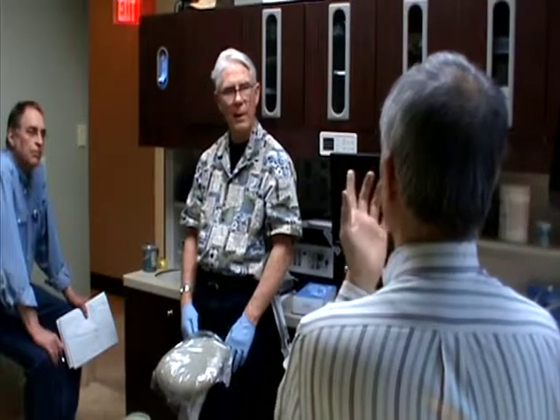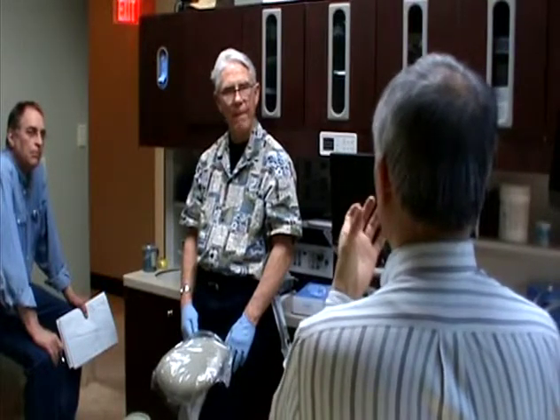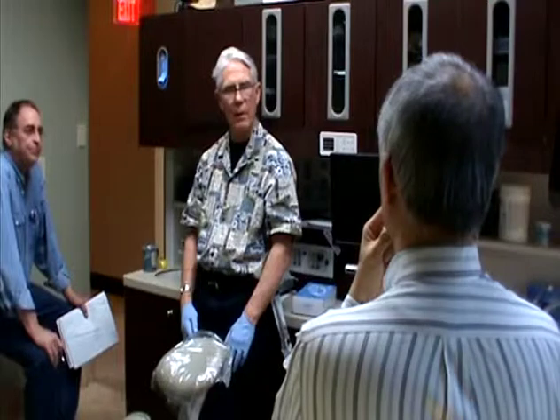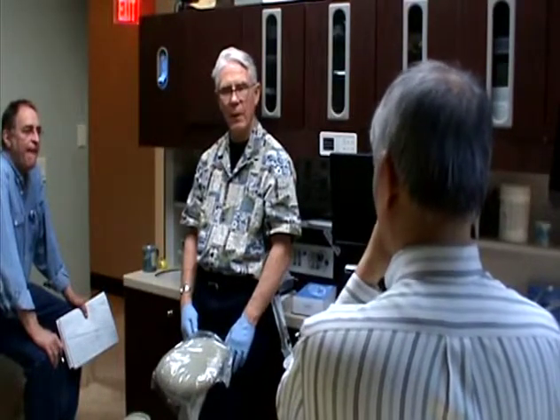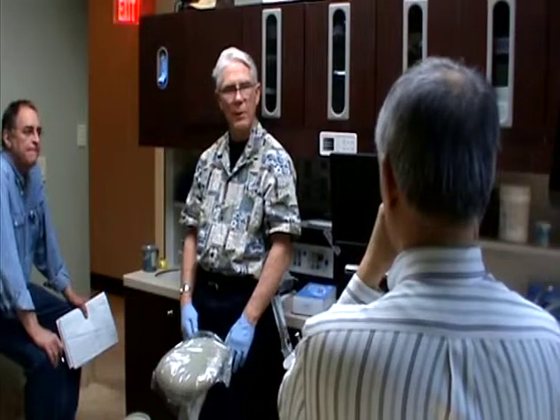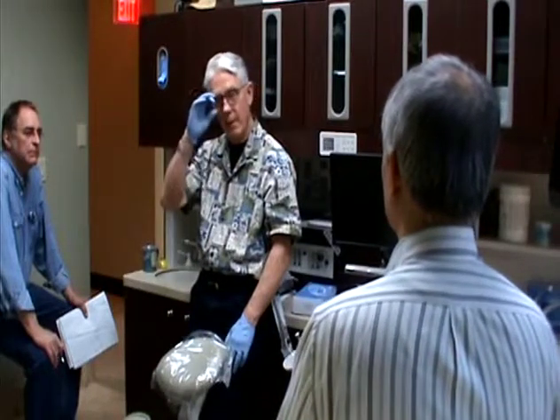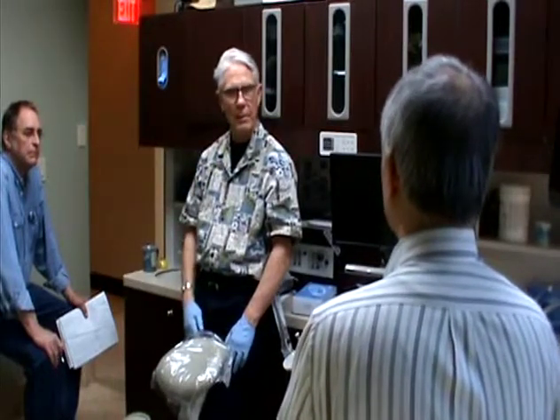I don't want to start without knowing how that part's going to get done. Build up. Everything you do is build it. You've got to get her comfortable first with an appliance and then build it all up there. It might look funny, but it's what you can do for her. Just follow the protocol. The protocol doesn't change. The patient may not like it.